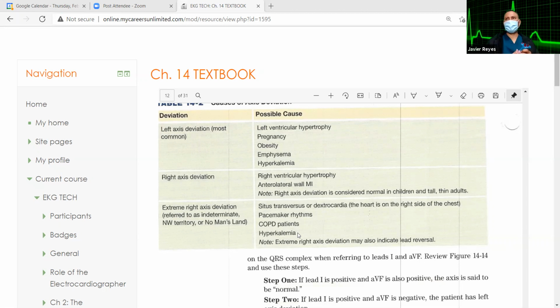That's a rare condition. I did have one patient. I think you mentioned. I did, right? No, the one that you mentioned was the one that was like to the side, no? Yeah, him. Dextrocardia.